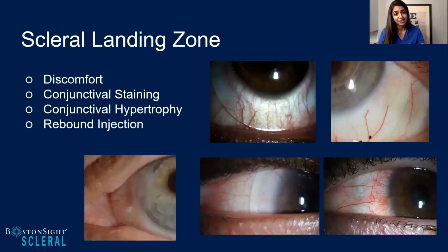So the scleral landing zone, a lot of this is going to be associated with not only the fit of the lens, but also how your patient feels with their lens on. So part of it is the comfort, any discomfort, whether it's a pressure sensation because the edge is too tight on the eye, or an edge sensation where the patient keeps catching the lens. Really evaluating your scleral landing zone is crucial. Conjunctival staining, as I mentioned before, I use my lissamine green religiously to really look to see what the edge is doing to the eye.